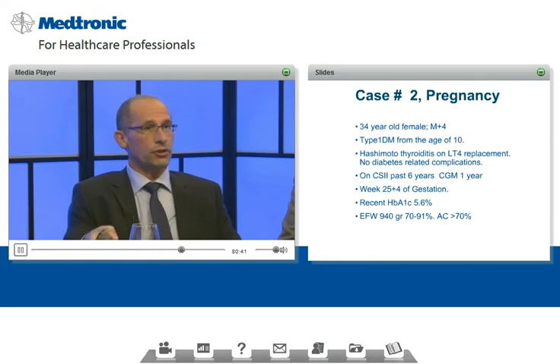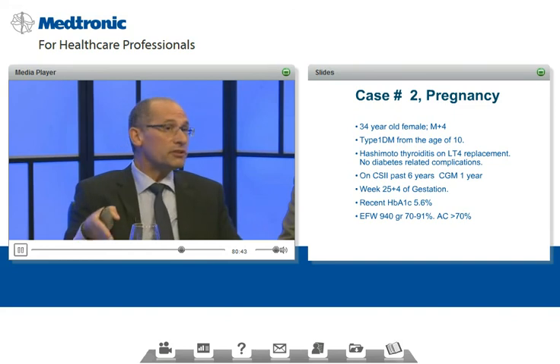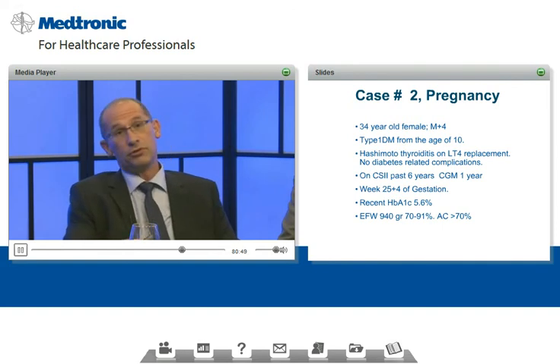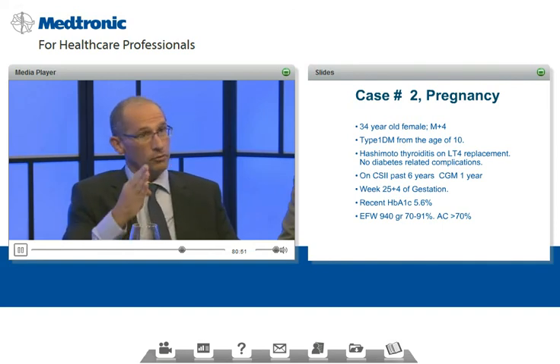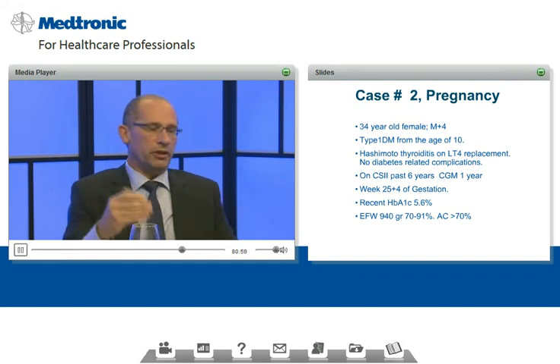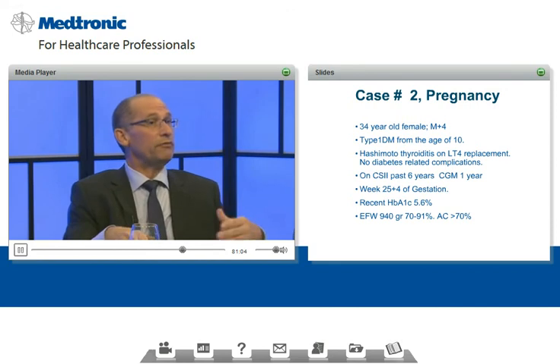Luckily for us in our country, CGM, or continuous glucose sensing, is reimbursed for every pregnancy for 15 months, which is a good idea. So almost the big majority of our patients are on pumps and CGMs at least during their gestation. On week 25, she comes to our office, and during pregnancy, we see these patients in the high-risk pregnancy clinic every 2 weeks.